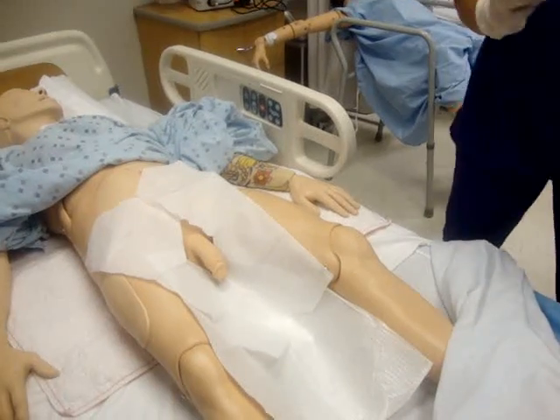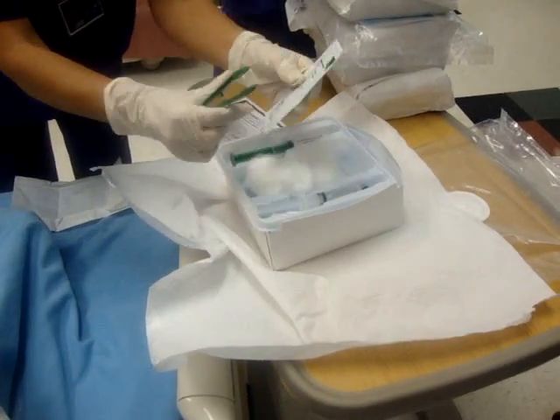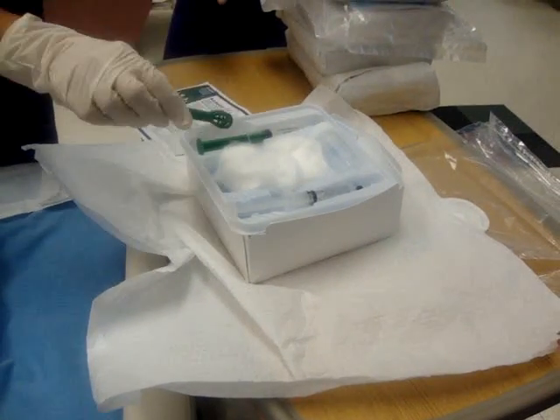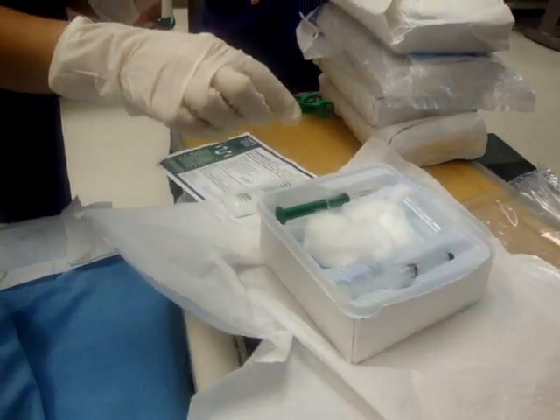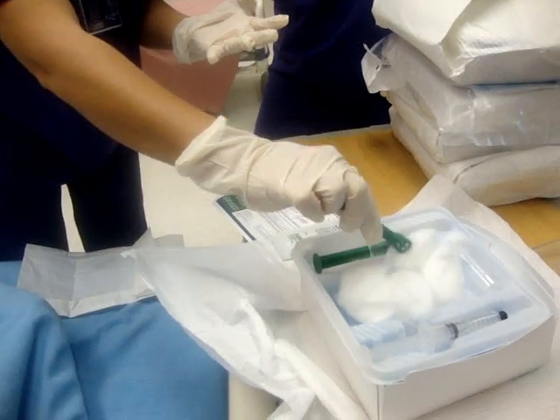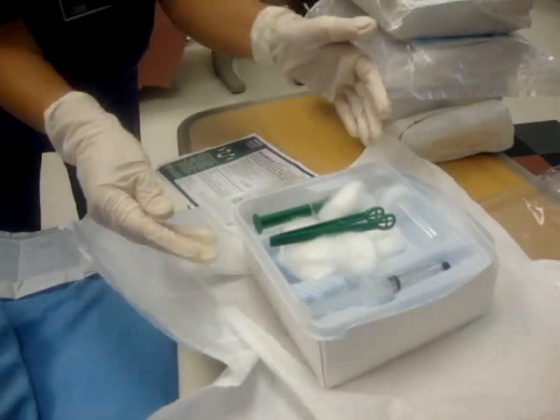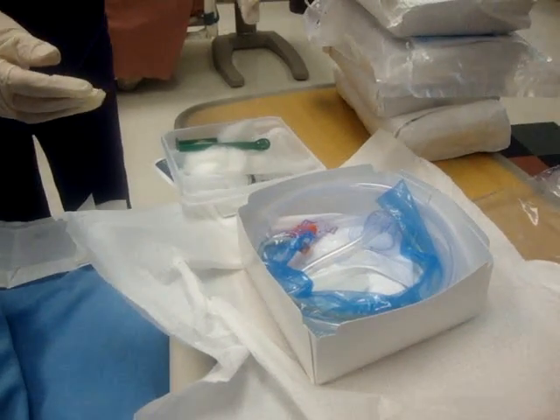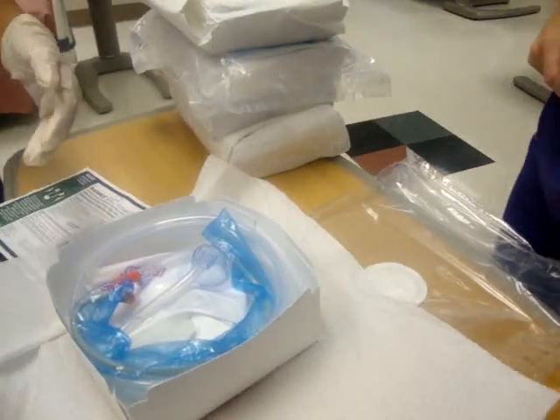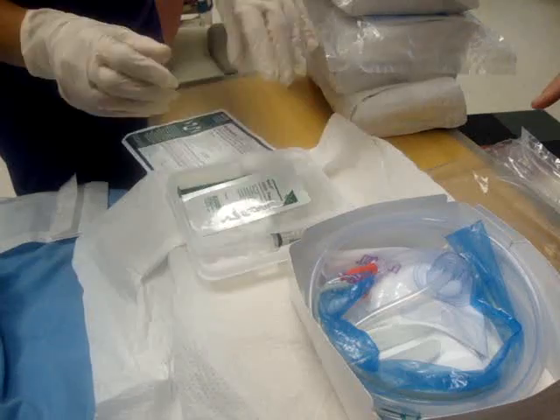Is that plenty? Yeah, that's fine. So then this can go on the bed — just leave it there. At this point we would squirt the stuff over the cotton balls, and then these — just throw it here. Don't touch anything; you just touched your shirt, you just touched your name tag. These are sterile fingers. Even though you don't have a gown on, you can't be touching all over everything. What are you going to do first? You're not going to go over there and prep first — we need to check the Foley. You've got to get your catheter ready. Now that's contaminated — you just said it right there. Where should it have gone? You have to pick this up and move it.